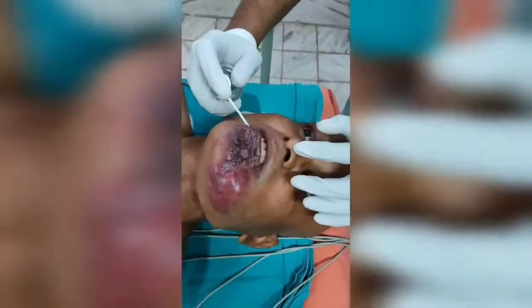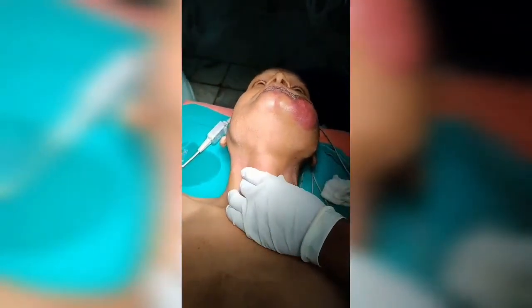Cleaning of parts was done with a spirit swab, and a superior laryngeal nerve block was given with injection lignocaine-adrenaline, 3 ml each on either side, with the landmark being the greater cornu of the hyoid bone. A topical lidocaine in the form of 10% lidocaine spray was sprayed into the oral cavity, ensuring anesthesia of the oropharynx. Following this, a transtracheal block was given with injection lignocaine 4%, locating the cricothyroid area through the anterior collar opening and marking the area.